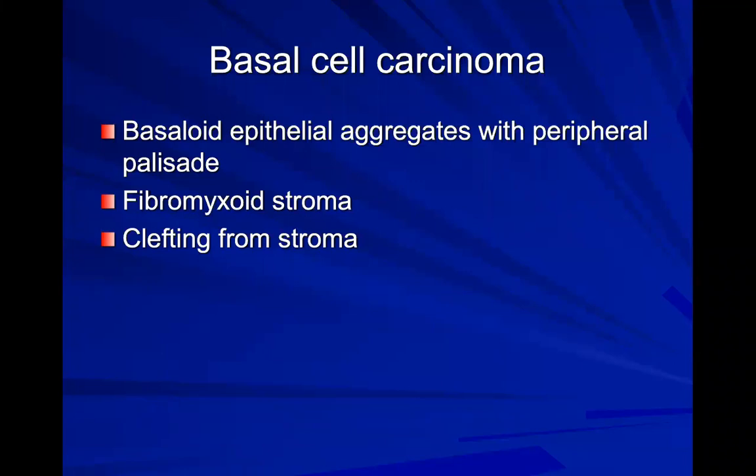Basal cell carcinomas are derived from the hair follicle. We used to think a long time ago that they were from the basal layer of the epithelium, but that doesn't really make sense because the basal layer is not that blue. What is blue is the hair follicle, like the matrical portion of the hair follicle. These probably come from the stem cells in the bulge, which give rise to the matrical portion.